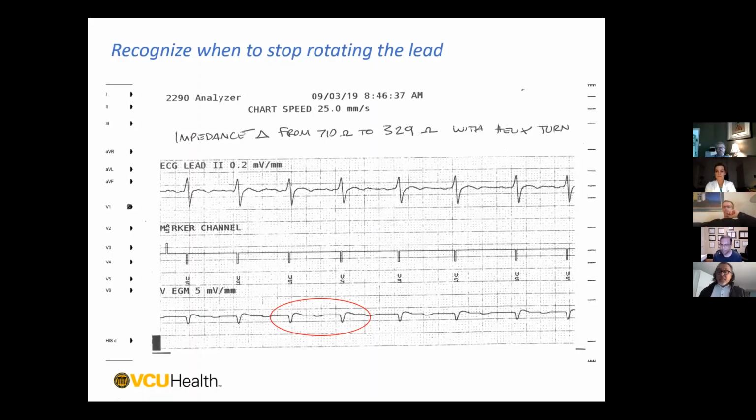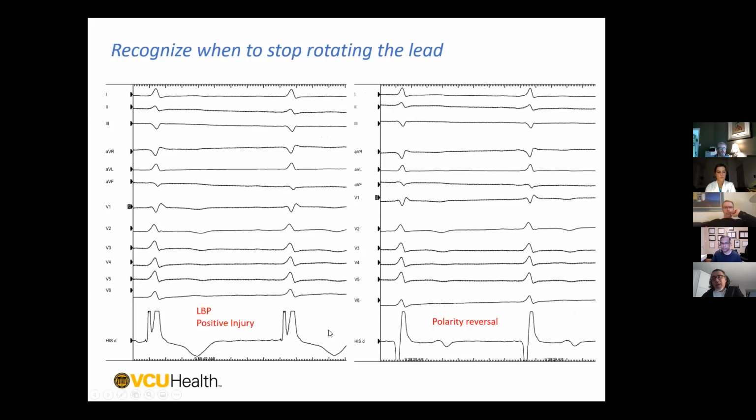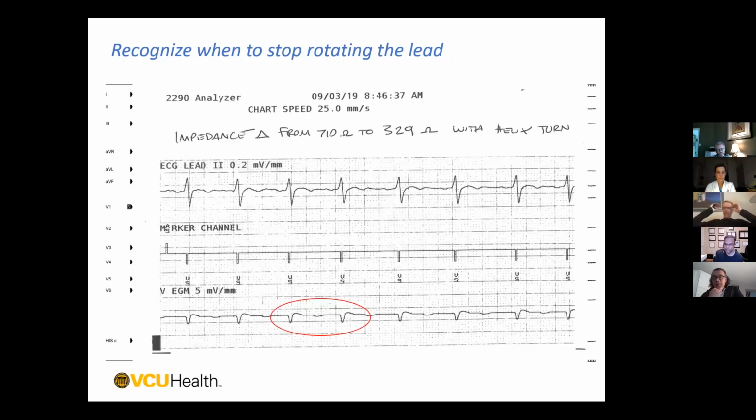I have to admit, I don't look very much because I really take a look at the paced impedance and the paced QRSs. Although the change in vector, which was mentioned as well, I do see that frequently. I've been challenged by the cost of things. Just the cable, which is single use, is like $100, half the cost of introducers. I'm no longer using the Medtronic cable, to diminish cost, so I'm using just the standard cable you use for a standard pacemaker. So I'm not looking anymore at whether there's a left bundle potential.